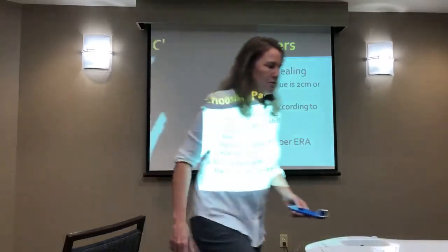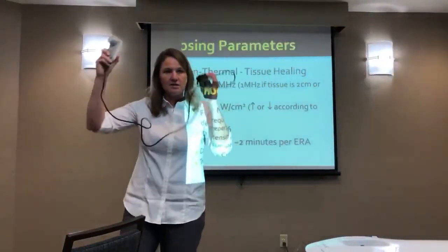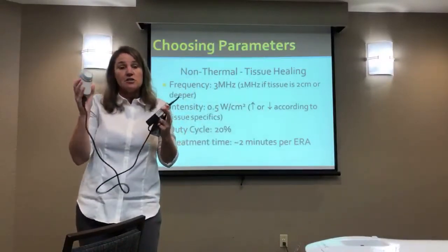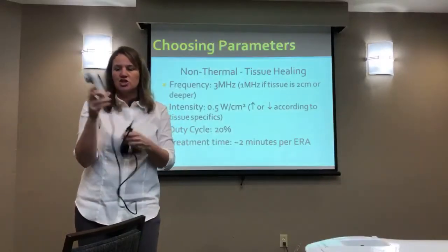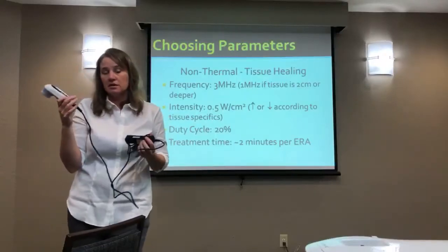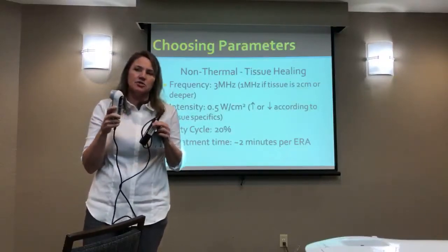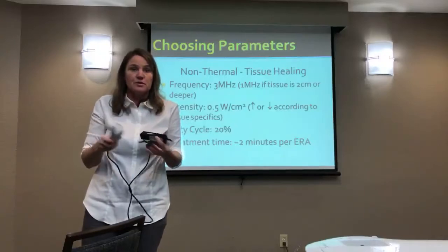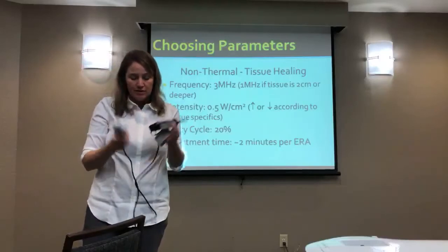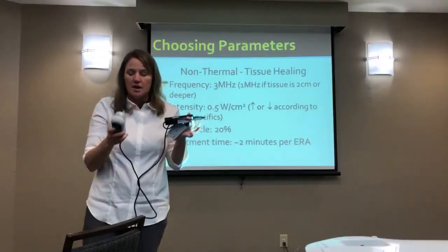Yeah, so I have this portable device. This is a Mettler product, and my battery's charging over there, but basically this is the portable. The battery would go in here, and when I first saw it in the ad, it just showed this part, so I envisioned it being just this. But when I talked to the company, they said that without enough power, you can't produce enough energy to replicate what we as physical therapists do. So you can't get a comparable amount of energy as with your clinical models, and that was as portable as you could get in order for them to get that amount of energy.